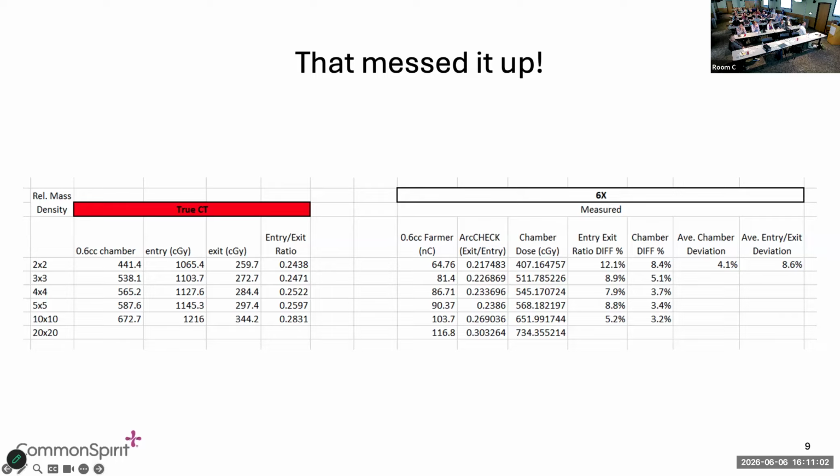But consistently through the years, I keep seeing the same number, whereas at a different site, using different algorithms, things like that, the pass rate is like 99% on 2 and 1, or 2 and 2, same threshold, and it is constant, hundreds of patients, 99% pass rate, easy. And that's what prompted me, okay, what happened? Why is this different? Is it the beam model? In every case, I'm looking at the beam model, and the beam model looks appropriate. There's nothing strange going on. It's just that for some reason, I'm getting different pass rates.